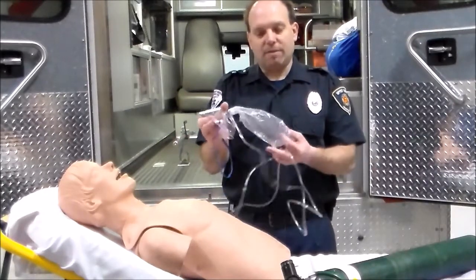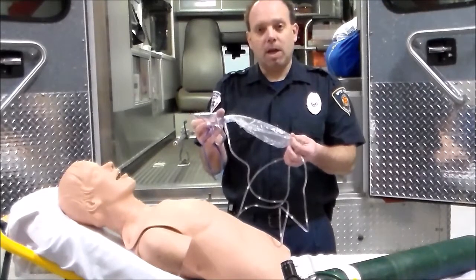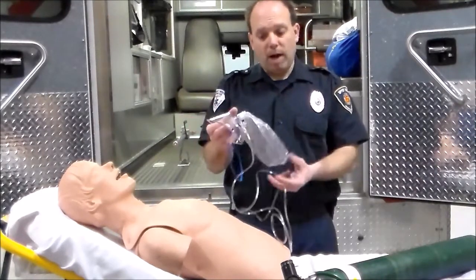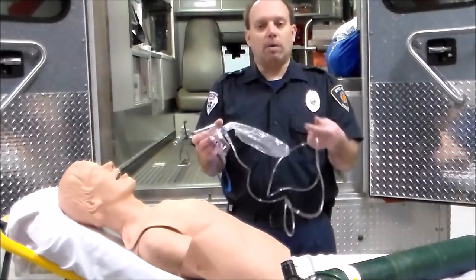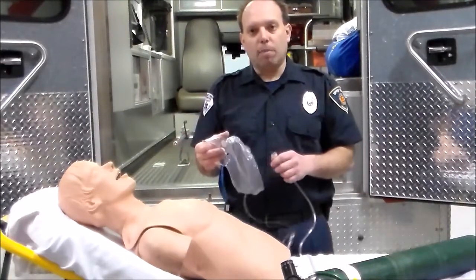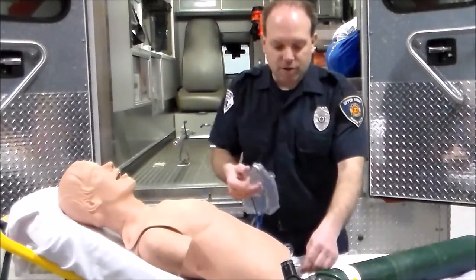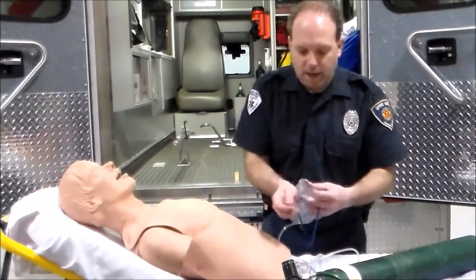Once the non-rebreather is applied, we check the bag to see whether it is deflating every time the patient breathes. If they deflate the bag and you have your liter flow set at 10, go ahead and increase it — go up to 12. If they're not deflating the bag, then you're set. It doesn't always have to be set at 15; you start at 10 and increase as needed. Anytime you put oxygen on somebody — particularly with a non-rebreather — make sure you've already hooked it up and have oxygen flowing through it first.